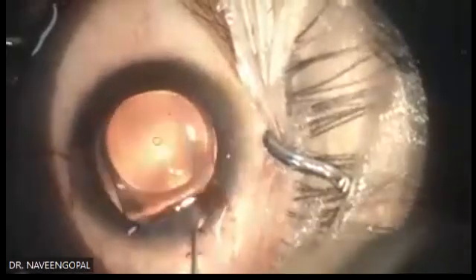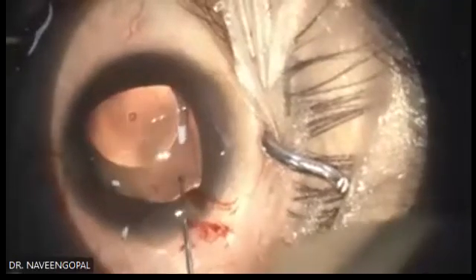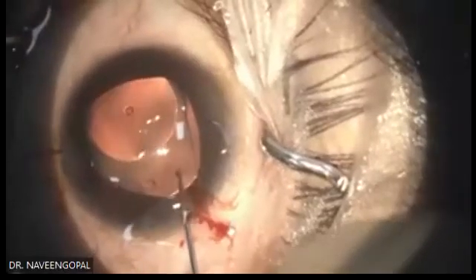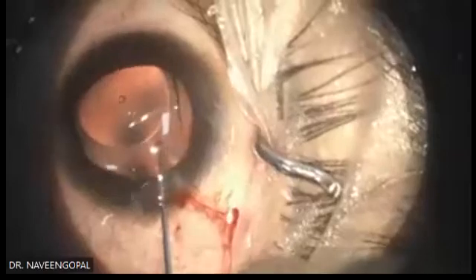The principle here is you cannot touch the crystalline lens. Since there is a central hole, you don't have to do PI. And biotech, I have used hundreds of biotech's phakic lenses. It is one of the best lenses I've used. Yes. Now it is in.